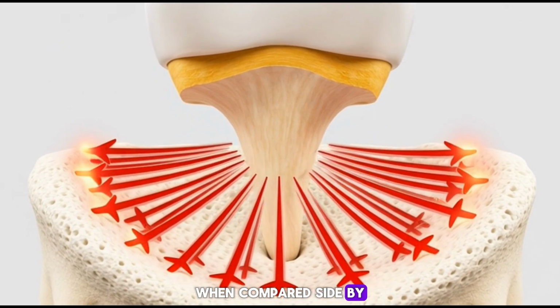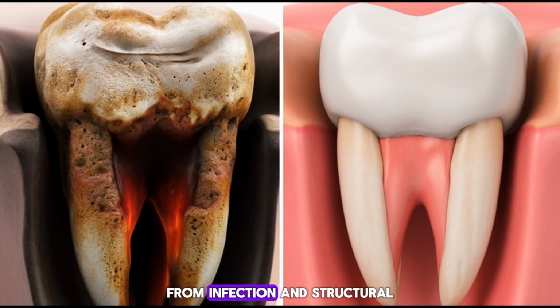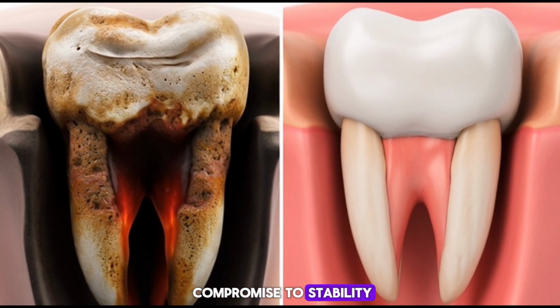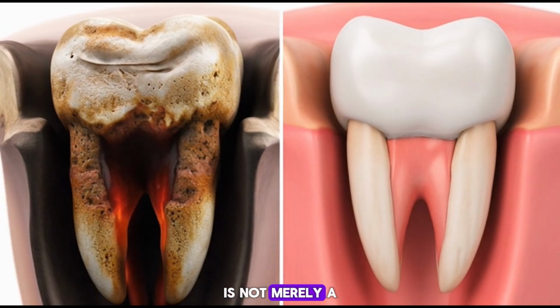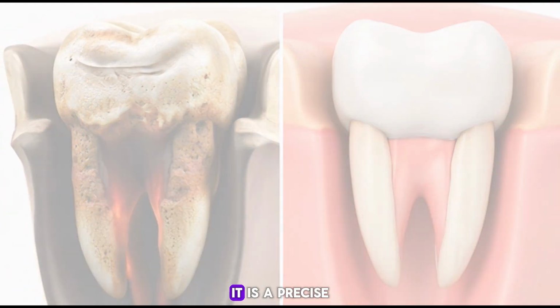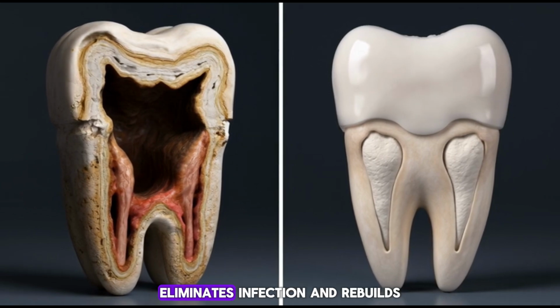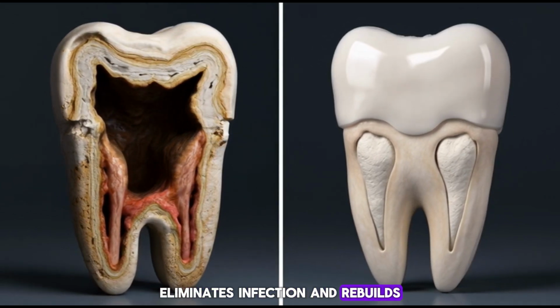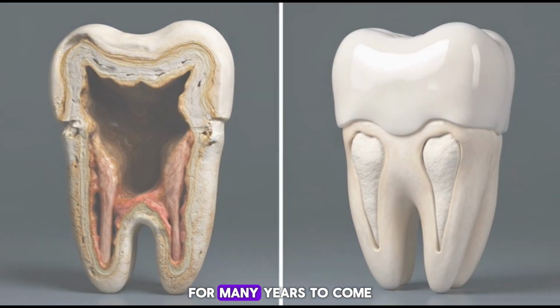When compared side by side with an untreated decayed tooth, the transformation is profound, from infection and structural compromise to stability, comfort, and restored health. Root canal therapy is not merely a procedure to remove pain. It is a precise biological intervention that preserves natural dentition, eliminates infection, and rebuilds strength from within, allowing the tooth to continue serving its function for many years to come.